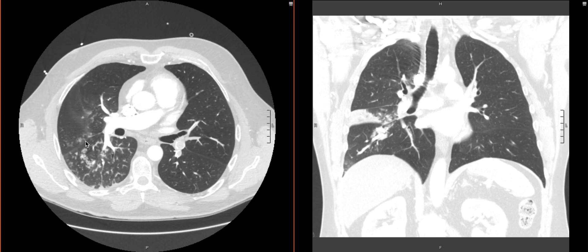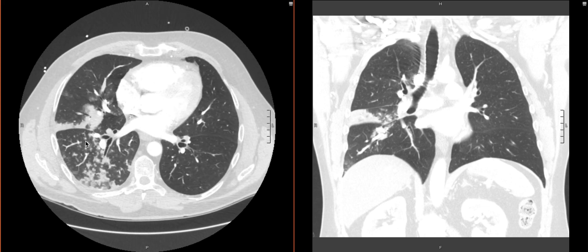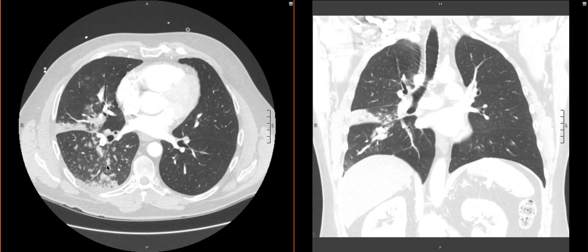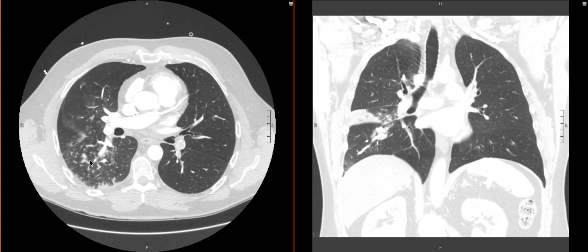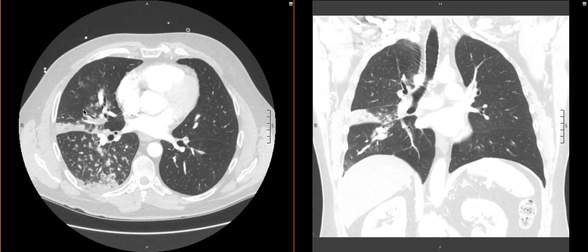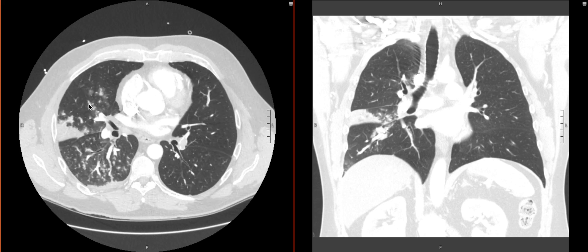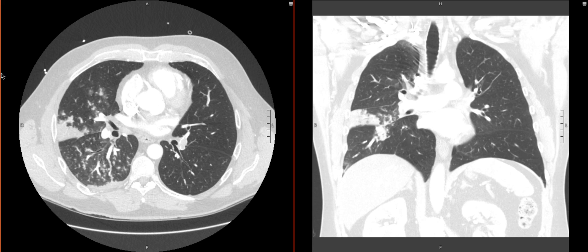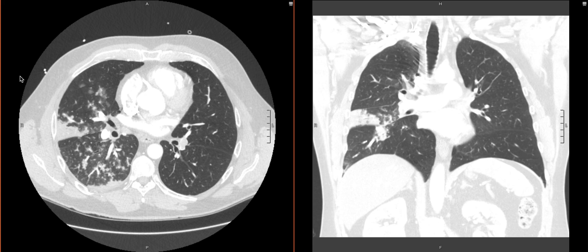This patient has multiple things going on, especially throughout the right lung. We see a lot of centrilobular, or more tree-in-bud consolidations, suggestive of infection or aspiration in the lower portion of the right lung, and there are also areas of ground glass. But what we really want to focus on is this very peripheral wedge-shaped consolidation — we can appreciate it here in the right middle lobe.